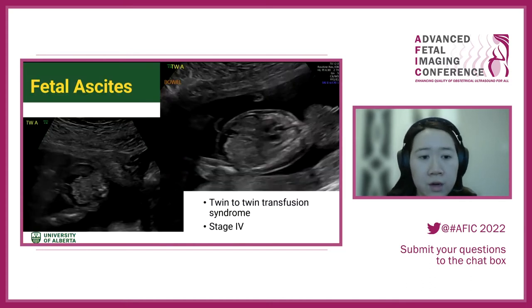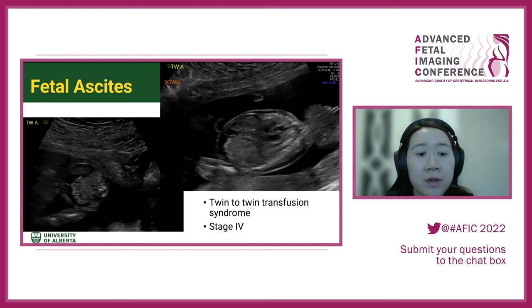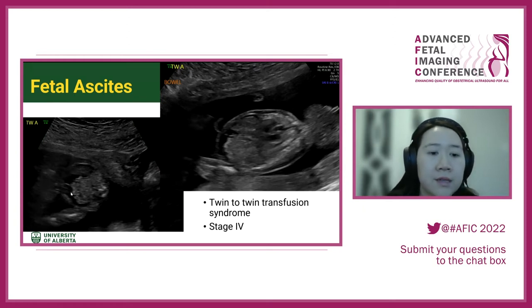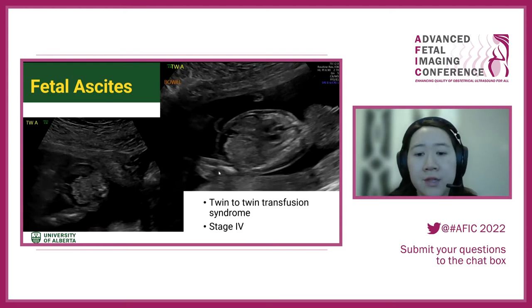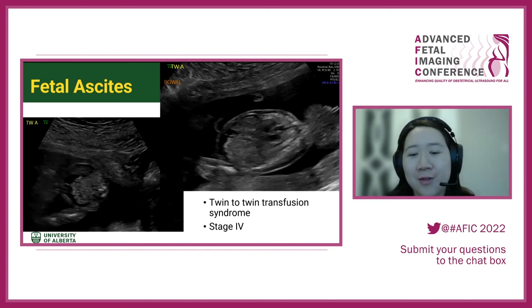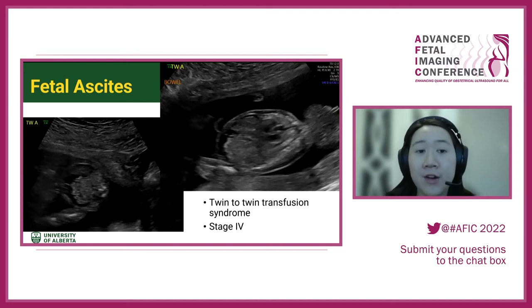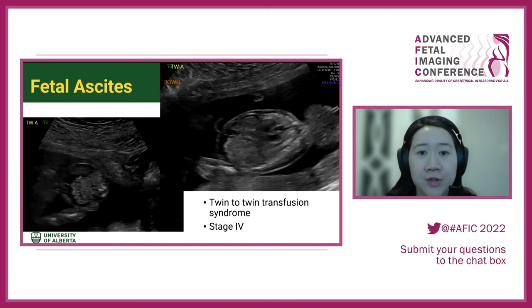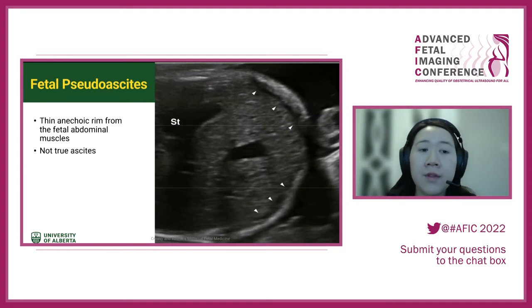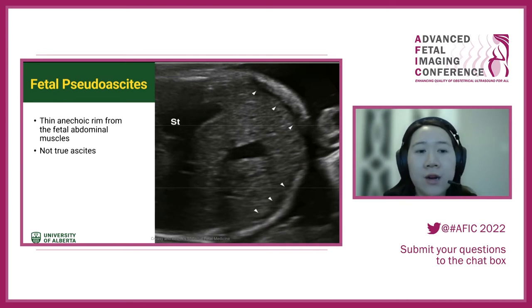This is a case from our clinic looking at a set of monodi twins. You can see a significant amount of ascites surrounding the bowels — a rim of fluid within the fetal abdomen. This was stage four twin-to-twin transfusion syndrome that had very timely transfer to Mount Sinai for evaluation and treatment.